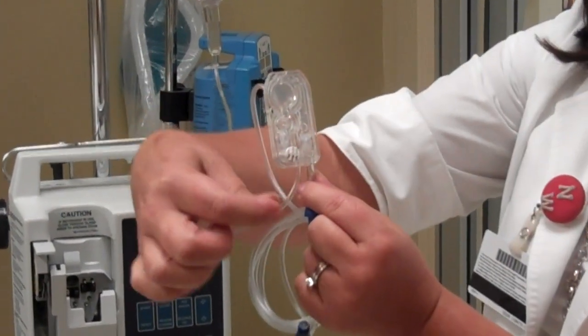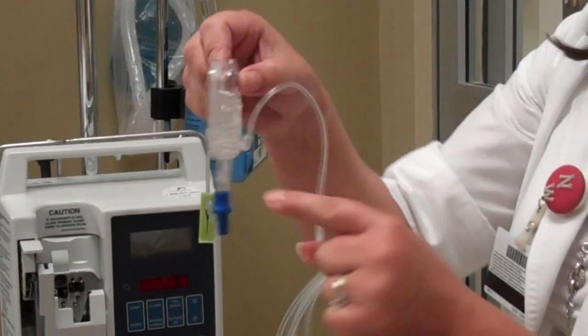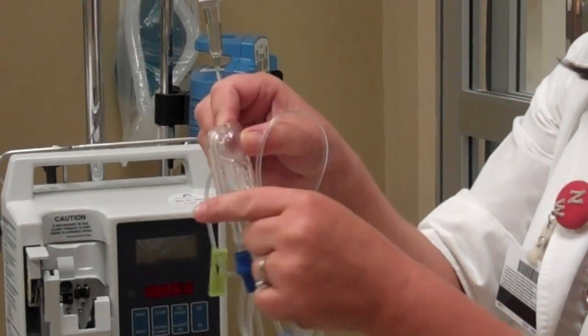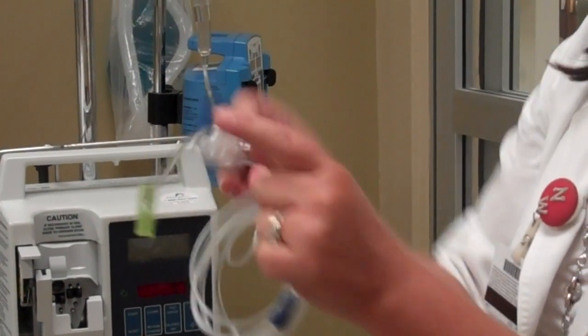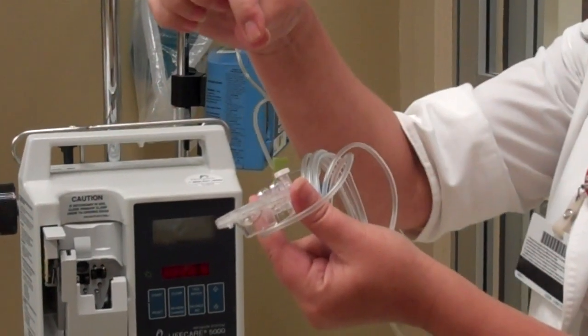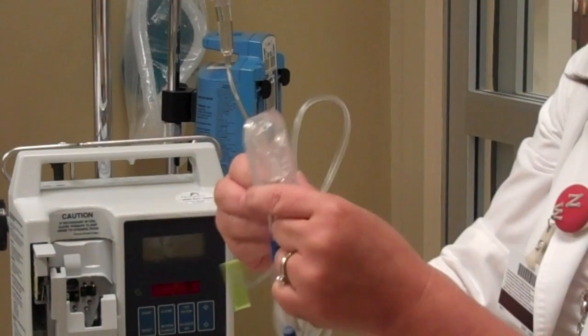What you do is you have to pull the white thing out in the back here. When you pull it out, the fluid is going to start to fill up. As soon as it starts to spill over into the little circle, you flip it. I know it sounds complicated but it's not. The further you pull this out, the faster the fluid will go, so if you pull it out a little bit it'll give you a chance to watch it.